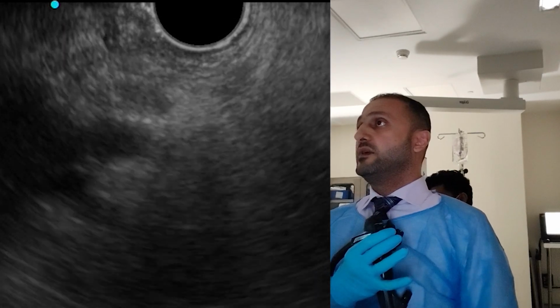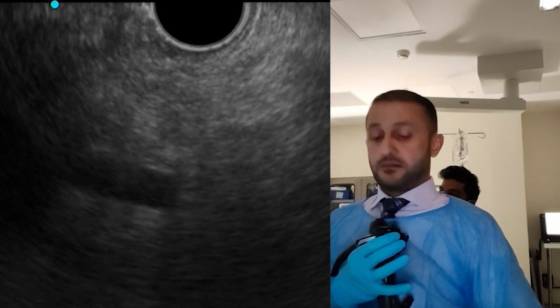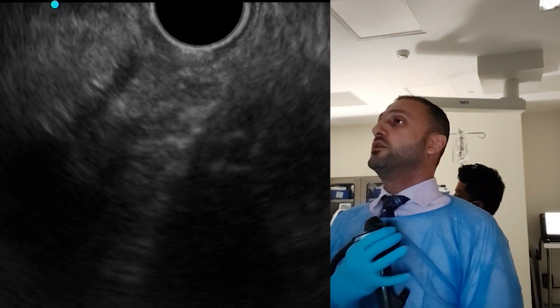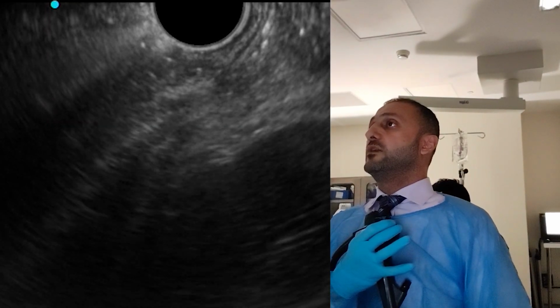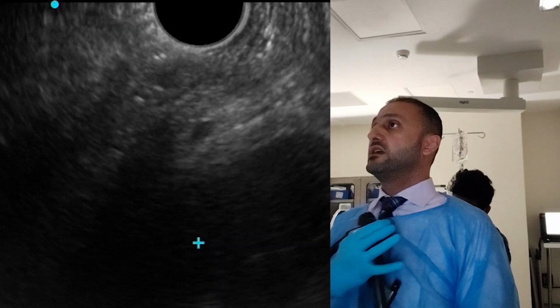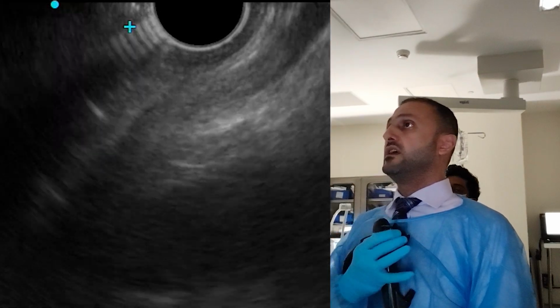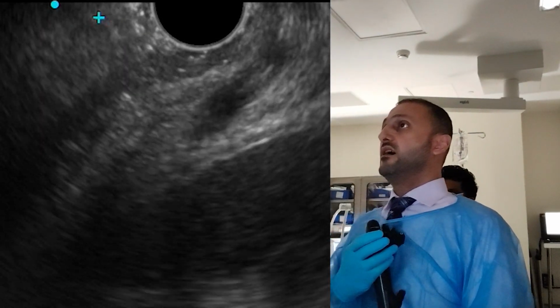So this is basically the pancreatic duct. Here is the pancreatic duct, starting at this point, where you can see this is the area of the pancreatic duct, starting point somewhere on this cross. Yes, this one, and it goes beyond that. We have seen it, of course, properly in the gastric position. Always head up.